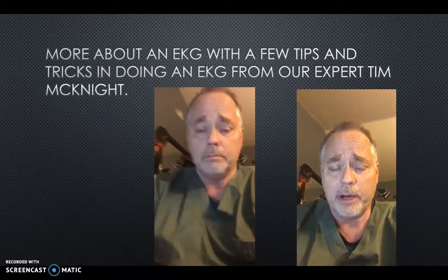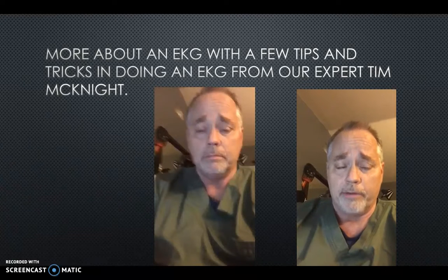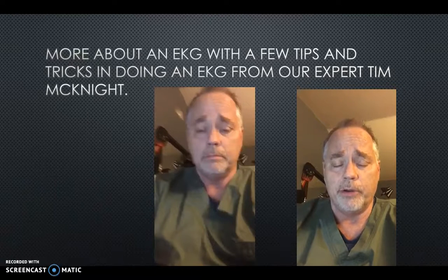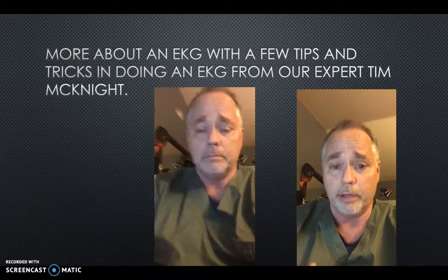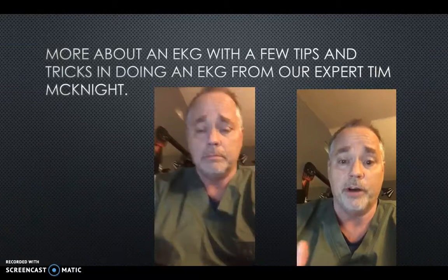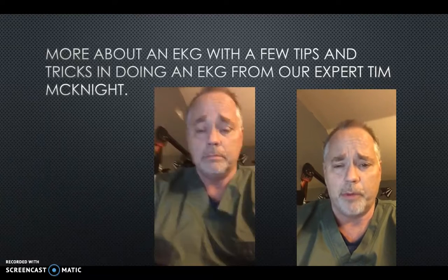You want to check for the placement of the lead itself. Sometimes altering slightly the placement of a lead will eliminate the artifact. And then your patient just moving as well. If you have your lower limb leads, or your leg leads, on the abdomen, sometimes just the motion of breathing can interfere with the quality of that tracing. What I would advise is to put those leads on the legs, because when you breathe, your legs don't usually move.